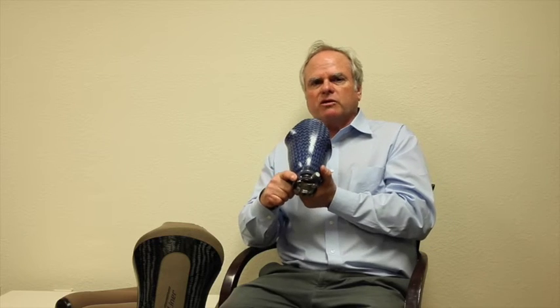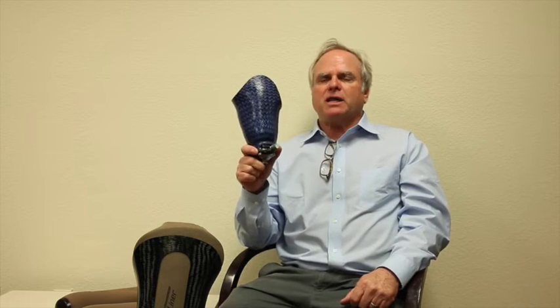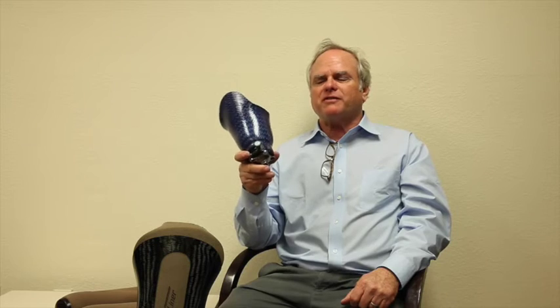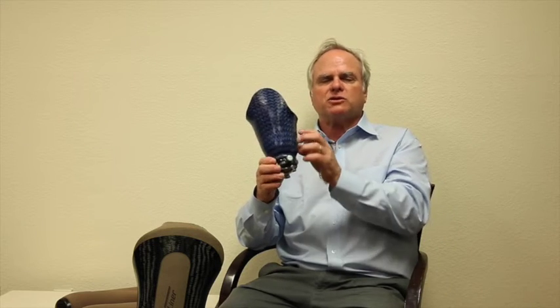And I highly recommend that any of these locks with the slide, with this hole that we have to put in near the screws, that we use NSP in this area to make sure it is adequate strength. Nylon stockinette, fiberglass, carbon fiber, all are not strong enough within themselves. If you're going to use carbon fiber, add the carbon fiber strips to make sure you add some extra strength within that.